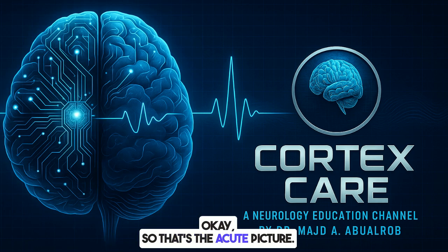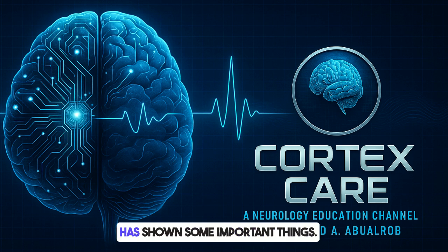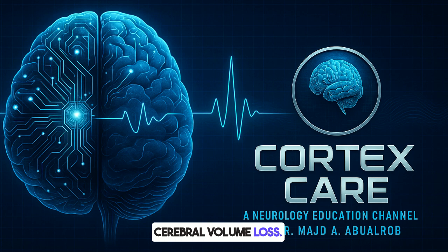Interesting. Okay, so that's the acute picture. What happens down the line on follow-up MRIs? Longitudinal studies tracking patients over time have shown some important things. Sometimes there's a reversible cerebral volume loss. The brain looks a bit smaller temporarily but bounces back.